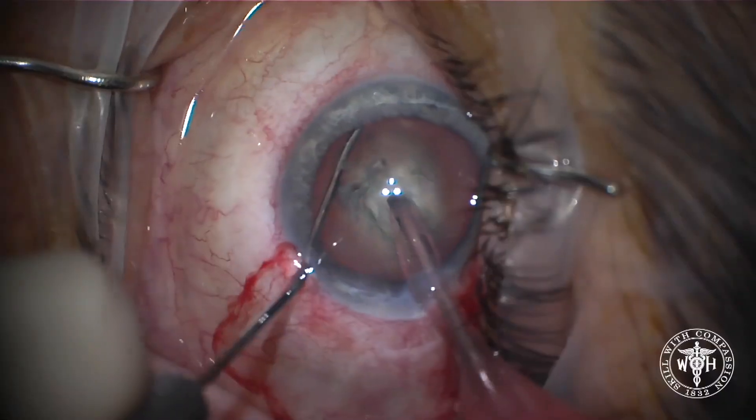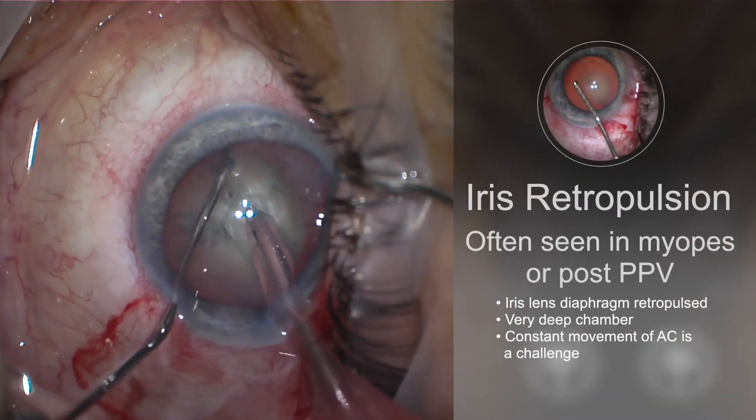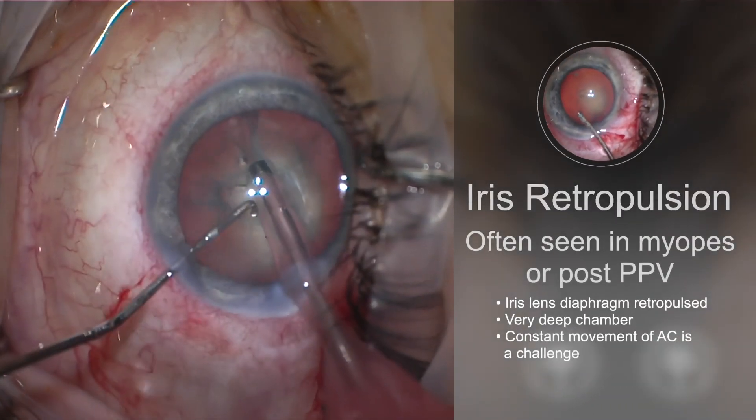In this case we're going to use the flexible iris retractor to solve issues with iris lens retropulsion syndrome that we often see with our high myopes or post-vitrectomy patients during cataract surgery.